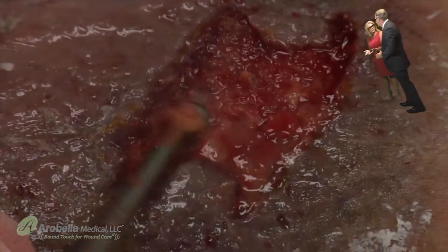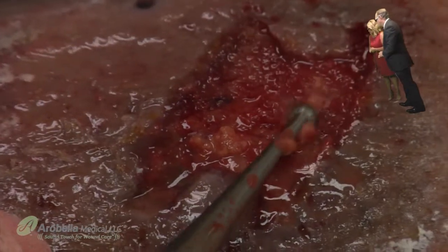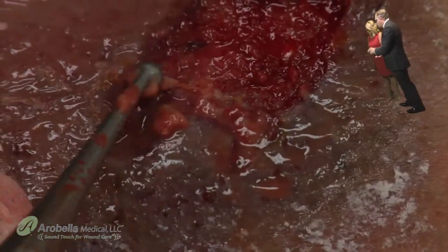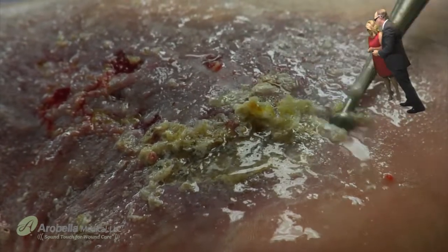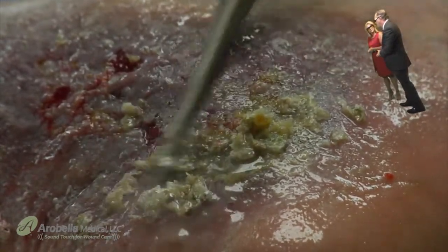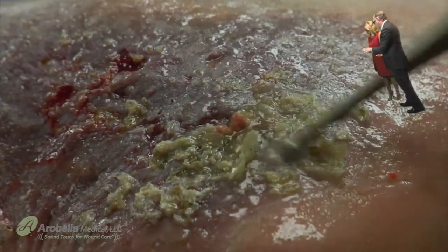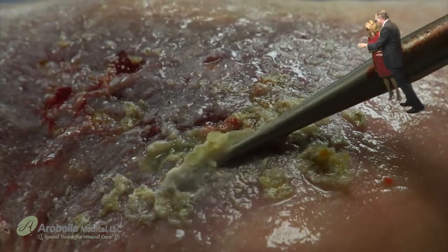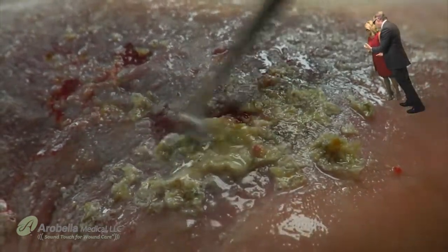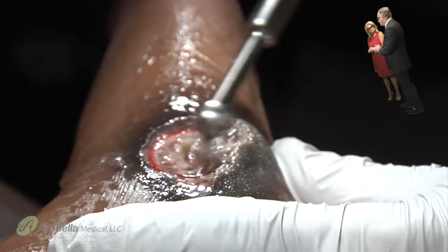Studies show that with multiple debridements we're decreasing the bioburden, and with ultrasound added, you're actually manipulating the cells to a greater extent — you get cellular stimulation in addition to bacterial killing. You get the best of both worlds. The wonderful design of the system is the curette — Elias was ingenious in coming up with it. One thing I really like about the acoustic system is the ability to do excellent peri-wound debridement. This hypertrophic dermis and scaling is a nidus for infection — bacteria and exudate can collect under it, putting the patient at risk for infection and poor wound healing.